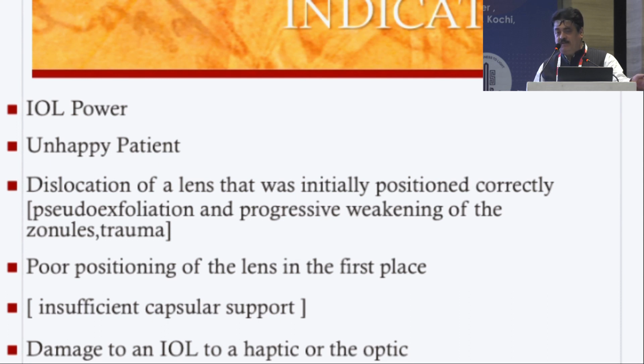There are many techniques. You can apply any technique. We cannot show all techniques in 5 minutes' time. So if you want to enlarge the incision, you do a SICS incision, 6 millimeter, you can explant the lens easily, no issue. But if you do not want to enlarge the incision, then we have limited options, and that is what we are going to discuss today.